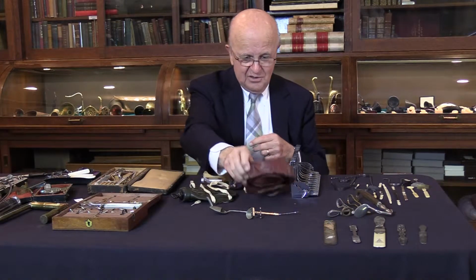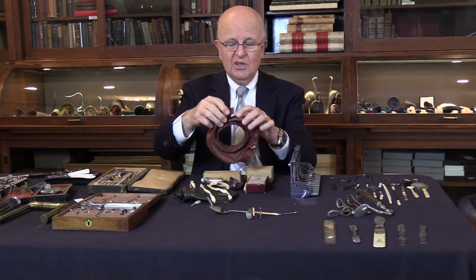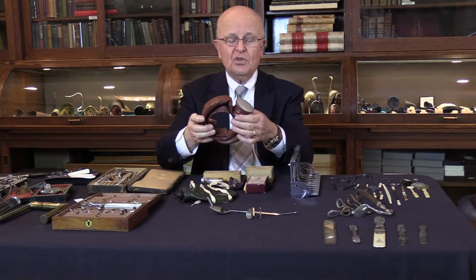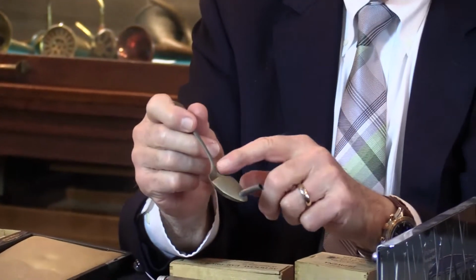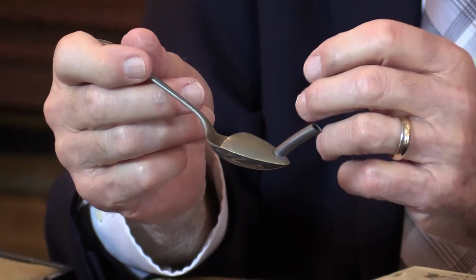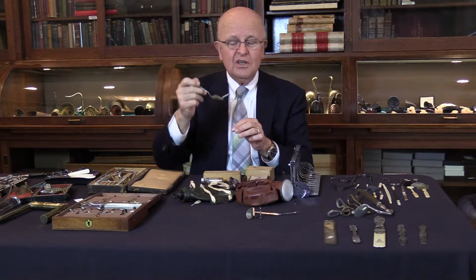There's another type, this one here, and the nice thing about it is you can make it larger or smaller. And again, you fill it with warm water. But more interestingly, they had this here. This is a spoon that they used to use warm or hot mineral oil. So they put the mineral oil here, and then through this cannula, introduce it to the ear.